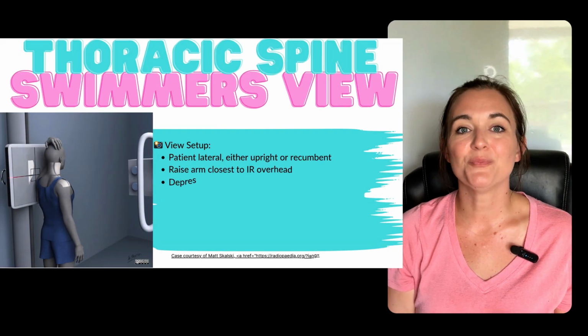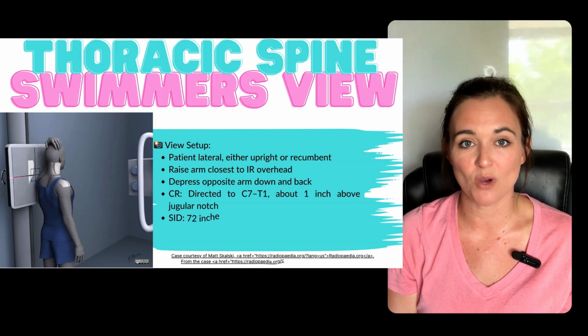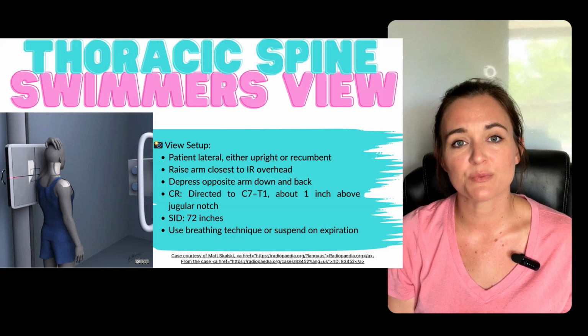Okay, so what if you do your lateral and surprise, you can't see T1? It happens all the time, especially with muscular patients. That's when we go to the swimmer's view.